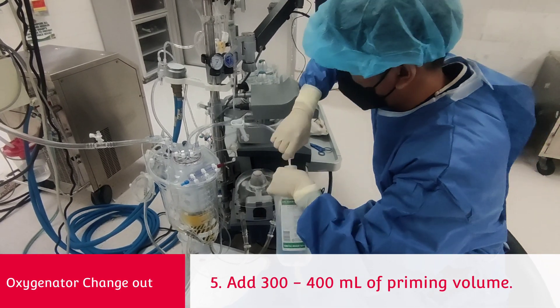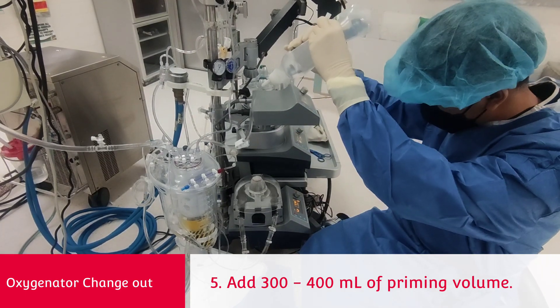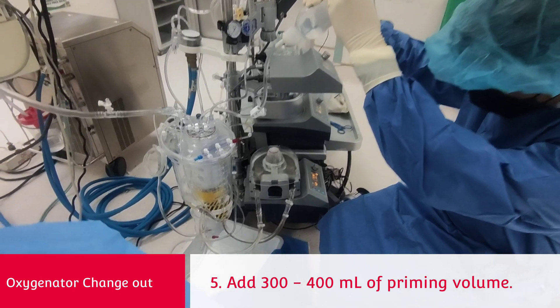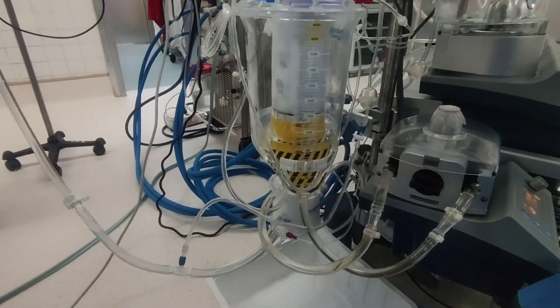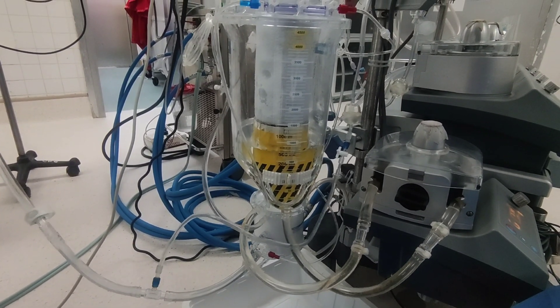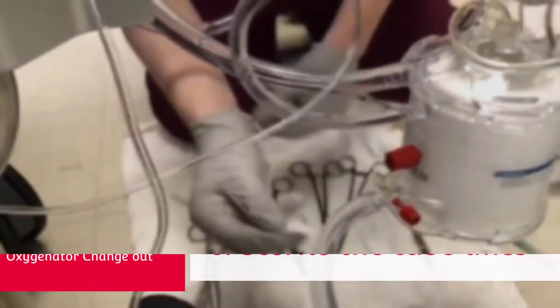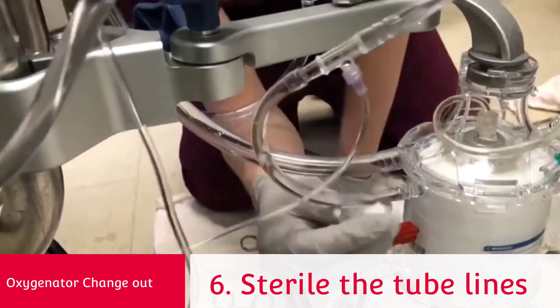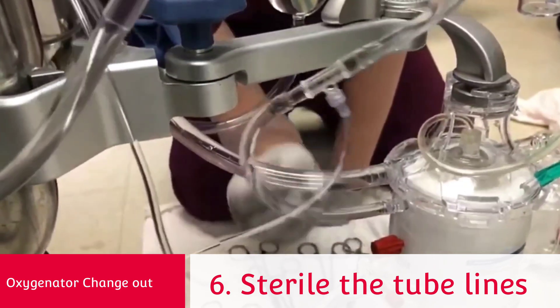Next, add volume, because approximately 300cc will be lost in the oxygenator being replaced. Then prep the lines using sterile technique, since these are connected to the patient. Swab each line where you are going to cut them.